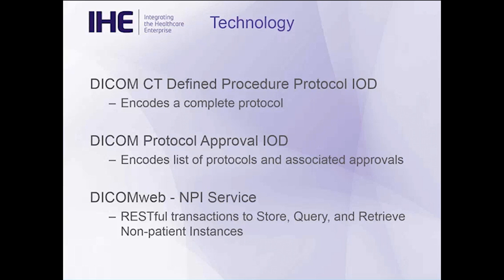Starting in 2004 and really kicking into gear around 2012, DICOM defined a number of RESTful services for doing the same things over HTTP connections. So basically using web-style programming and web-style protocols, which are a little more familiar to some of the modern developers. They're maintained completely symmetric with the DIMSE services so that they're fully proxyable and the like.